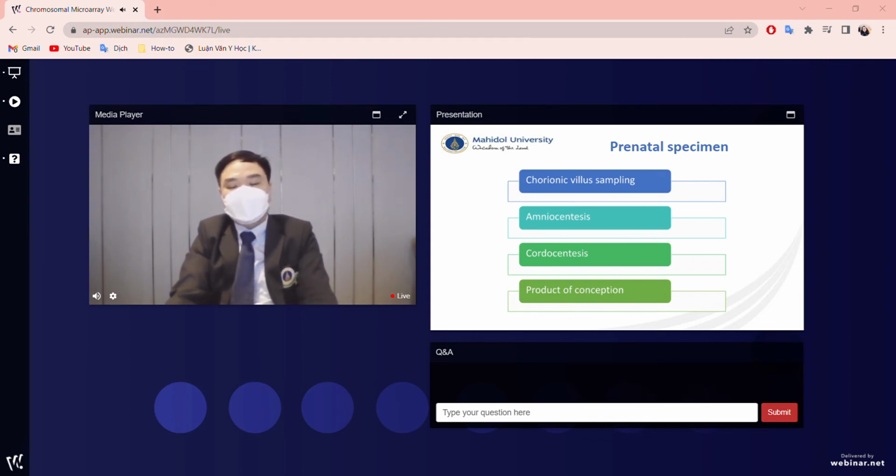Unlike conventional cytogenetics, CMA does not require a cell culture process for the sample, so it helps provide a short turnaround time compared to the standard karyotype.